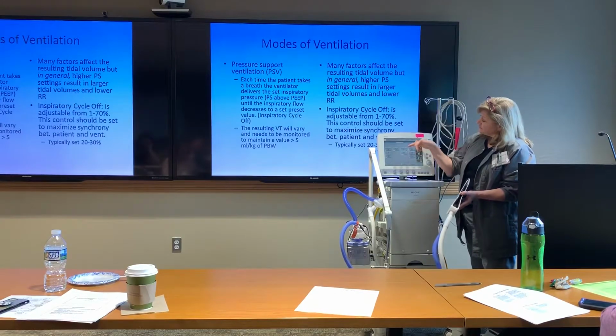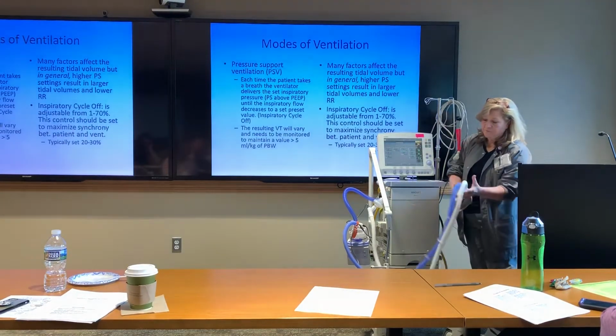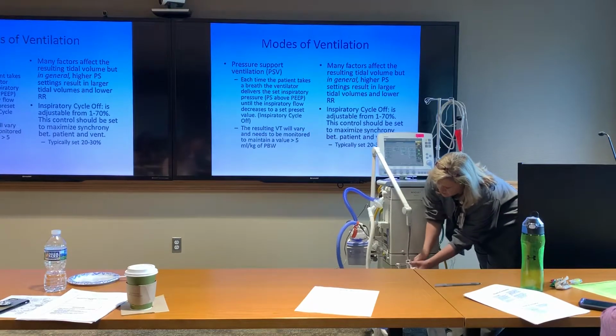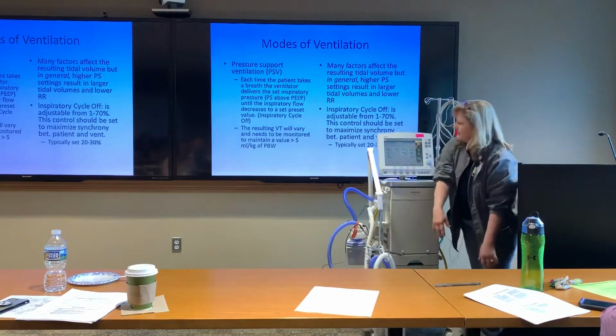The other thing I want to talk to you guys about right here is this thing called backup ventilation, because I've seen some interesting things get charted in a spontaneous breathing trial.